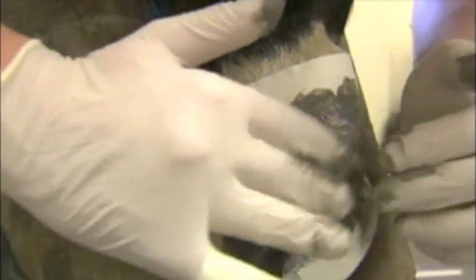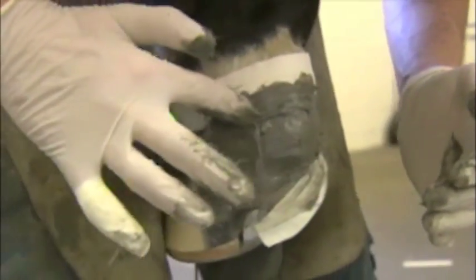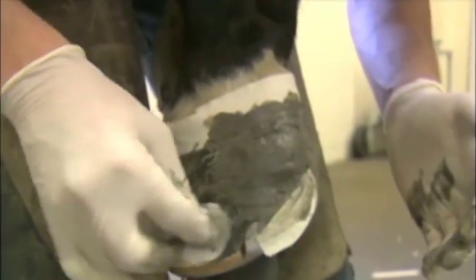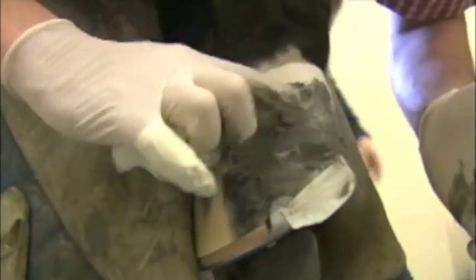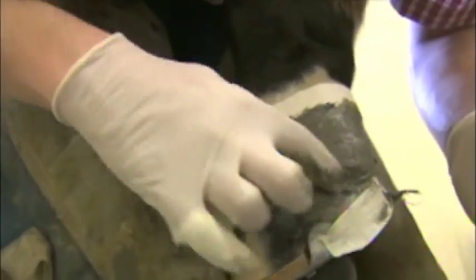Take a little extra glue just to clean up the edges. I put more glue on than I need at first, then I'll go back and clean up all the excess with some gauze. I like to wait for the glue to get kind of tacky and then wrap it with plastic wrap — that makes it really compact and strong, really presses the glue into the fabric and into the wall for a nice tight bond.